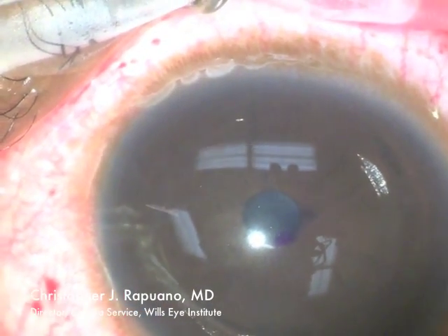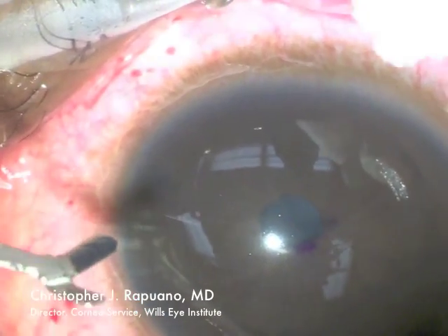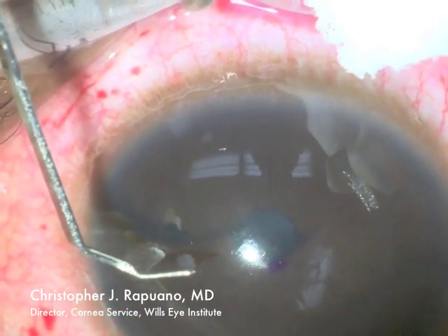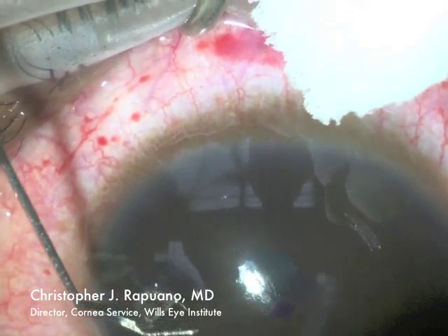The intralase femtosecond laser has already been used to create the corneal channels for the intacs intrastromal segments. Small air bubbles in the cornea can be seen at the 2 o'clock and 7 o'clock positions in this view.